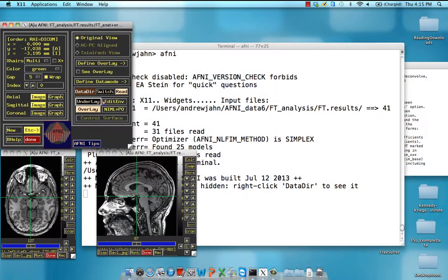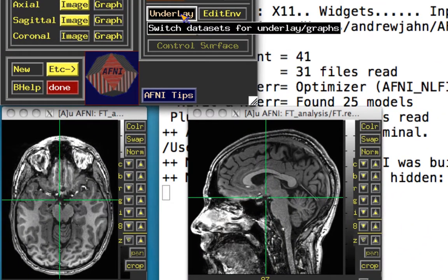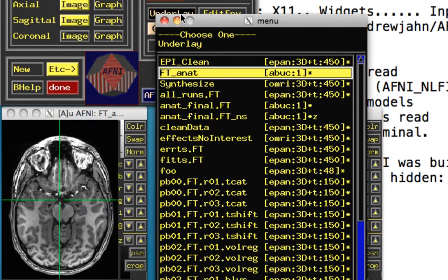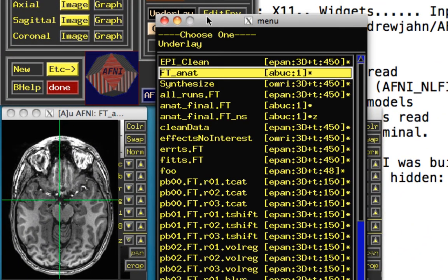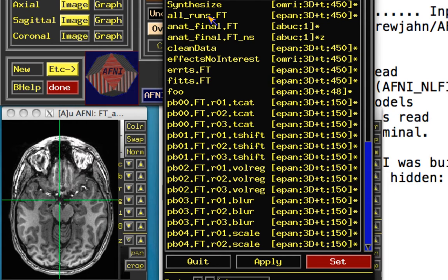So in AFNI, right now what we're going to do here is just try to build our intuition about what's going on. These steps shouldn't be taken as doing a proper functional connectivity analysis. We're just going to do something kind of quick and dirty, and later on we'll actually do it the appropriate way. So right now I'm using the AFNI data6 dataset, which I just did in my previous playlist. And so if you've already done that, you've already run the analysis.